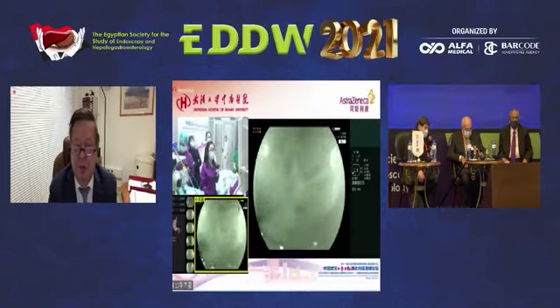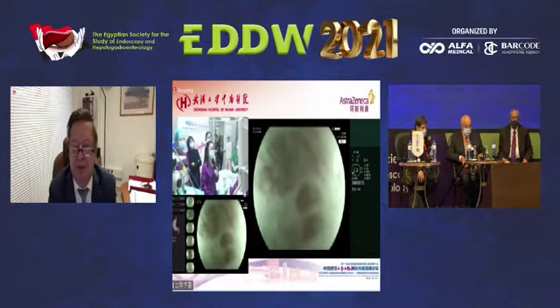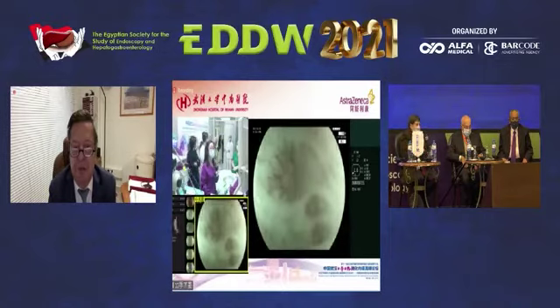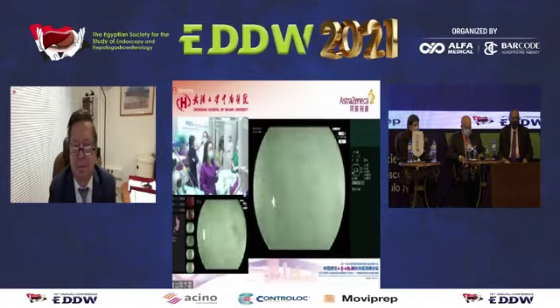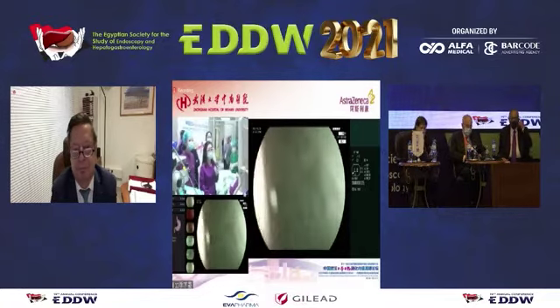There is still a chance for machine error. Do you think there still is? Of course, especially for detection, we have machine error. Depending on the software, we could have a lot of false positives. But for characterization, especially the system developed by the Shinji Kudo group, it has quite high accuracy.